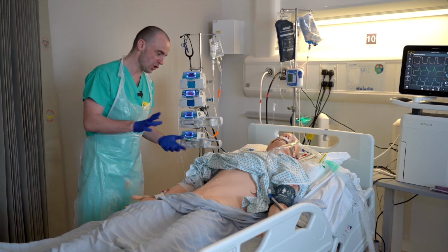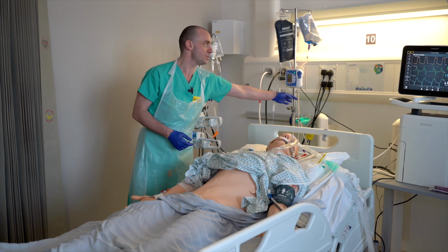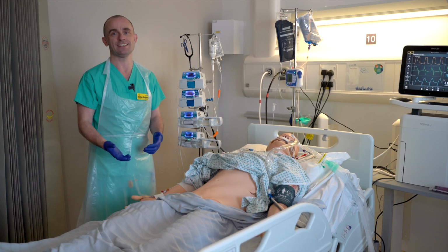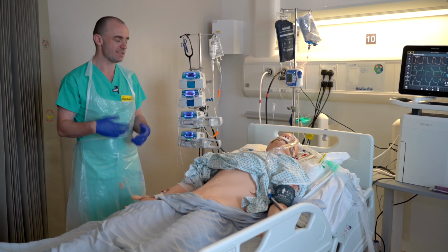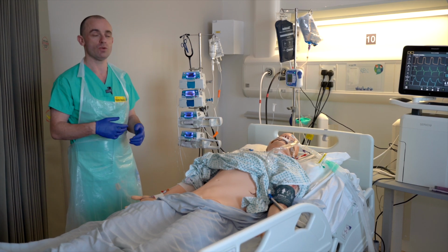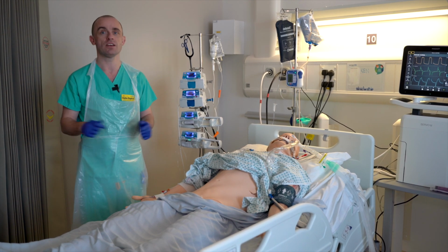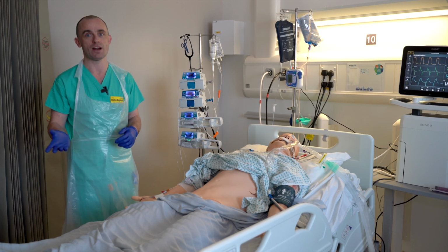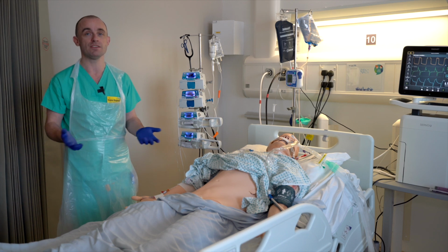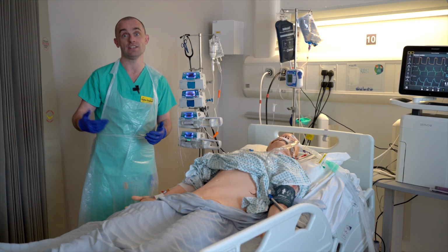Looking, I can also see that this patient is being fed nasogastrically, and here we have a tube connected to an enteral feeding set, and this patient is continuously fed whilst they're sedated and ventilated. It's important to make an assessment of how well that's working. So you need to look at what's usually called a gastric residual. The nurses aspirate an NG tube, usually every 4 hours. If the volume that they get is less than around 250 to 300 mils, they would consider that to be absorbing and therefore return the feed and continue feeding as appropriate.